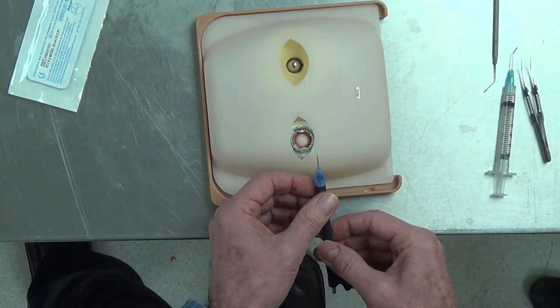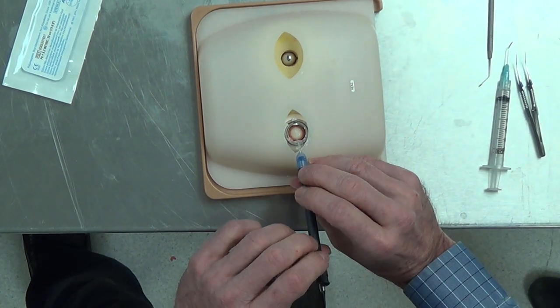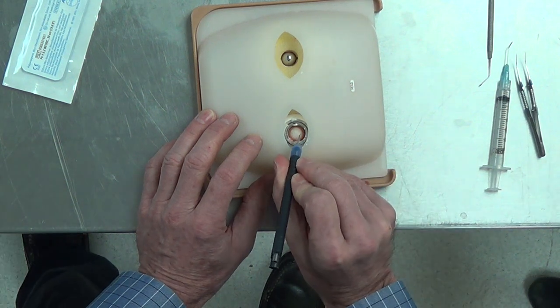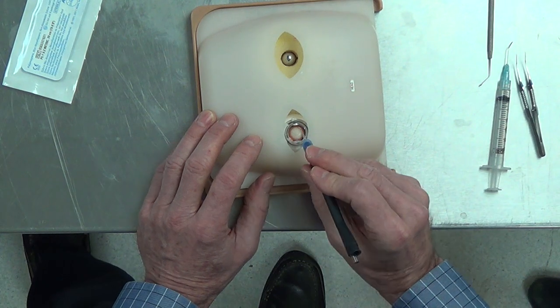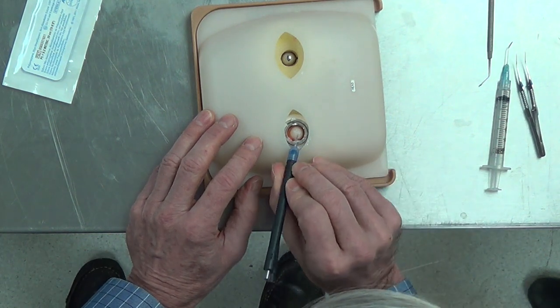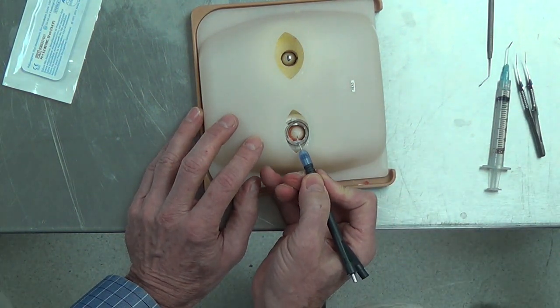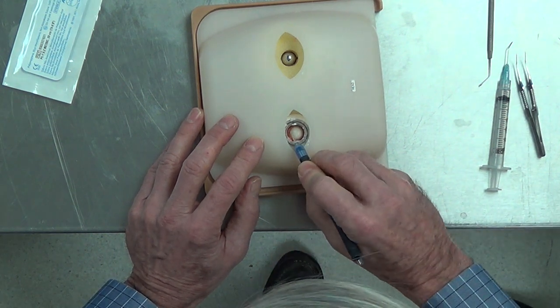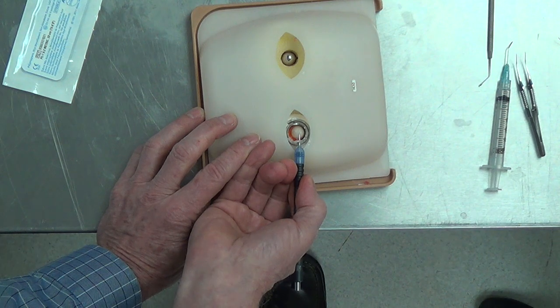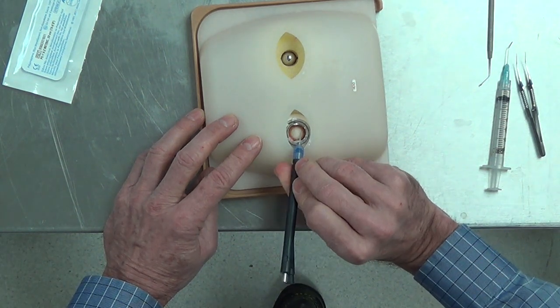The principle is the same for INA. You have an angled instrument and you want to hold it so that you can rotate it for the INA, get it under the capsule, and rotate it over to the other side. You have to be able to rotate the instrument at least 180 degrees while you're in the eye. If you held it like a pencil, you'd have to turn your wrist all the way down to aspirate here, and you'd be almost unable to reach the other side. Holding it like a dart, you can easily go 180 degrees away.